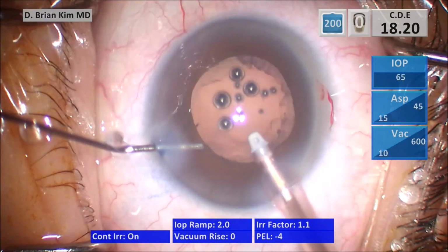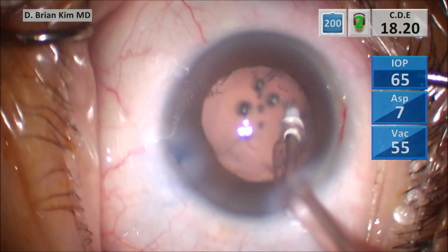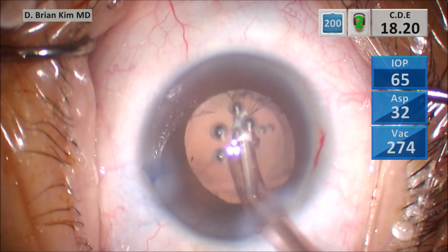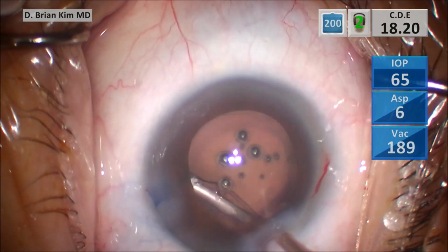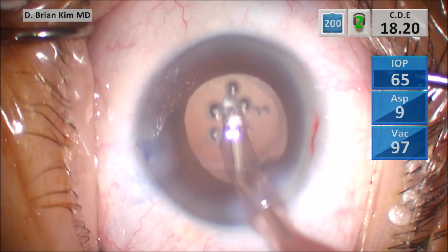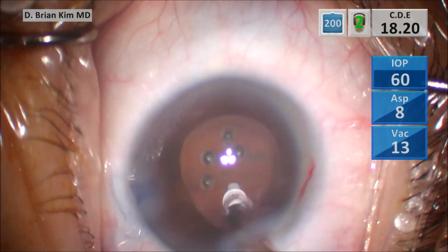But the reason why high vacuum and indiscriminate use of vacuum is not good is you can remove the dispersive viscoelastic that's coating the corneal endothelium, and then you're undermining the safety of your surgery because you're exposing the corneal endothelium to ultrasonic damage. And then you have steamy corneas. And remember this, if you have steamy corneas, you're damaging endothelial cells, and you wonder if that's going to have any long-term ramifications to the patient, and one day they might need to have a corneal transplant, a DSAEK or a DMEK, because of your surgery. So you really want to execute safe surgery whenever possible.